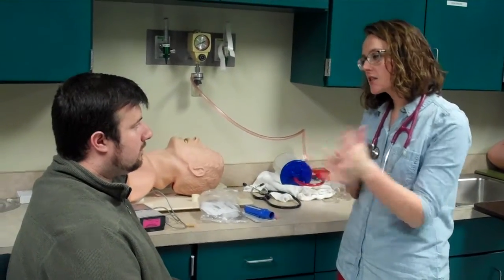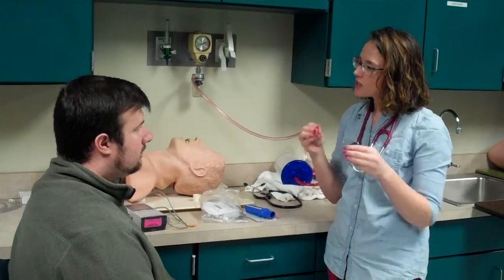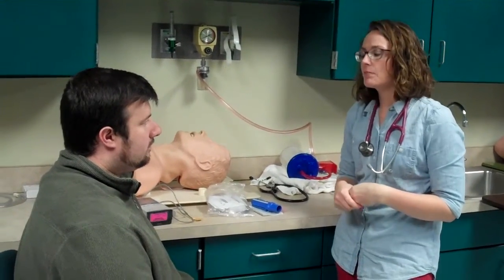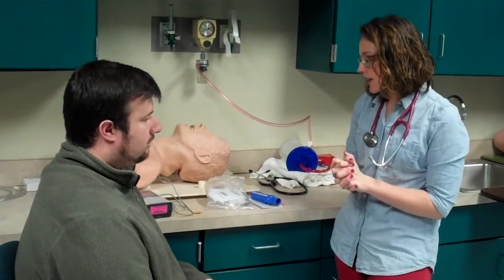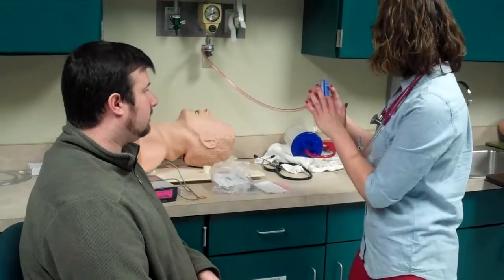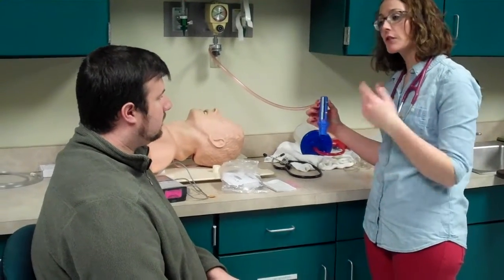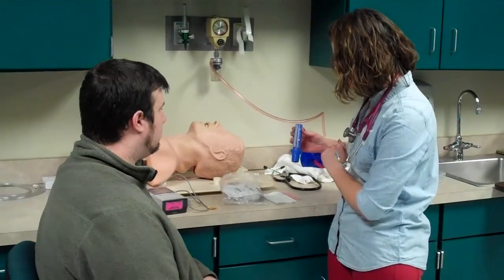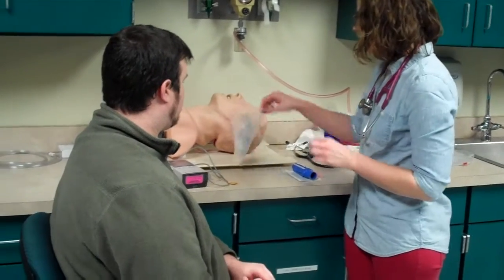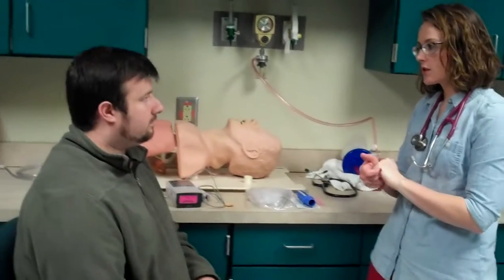Sometimes some people feel a little dizzy or lightheaded. Just let me know if you do. Sometimes it can cause some tremors or jitters, kind of make you a little nervous. But again, just let me know. It's not very common. Before we do that, I'm also going to do a little peak flow with you. This is going to measure your lung volume, see if they improved after your treatment. I see that yours is already set up here, so we're going to do that first. And I'll set this up and show you a little bit before I actually give it to you, okay? Do you have any questions?